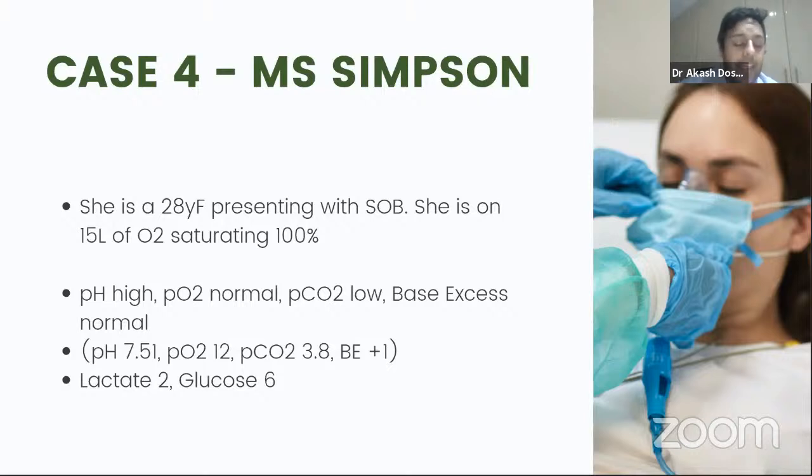The pH is raised. This patient is alkalotic. R, is this due to a respiratory problem or a metabolic problem? So R and M. R, the PCO2 is low because the normal is 4.6 to 6. Therefore, this patient is alkalotic because of a respiratory problem. They've got respiratory alkalosis.